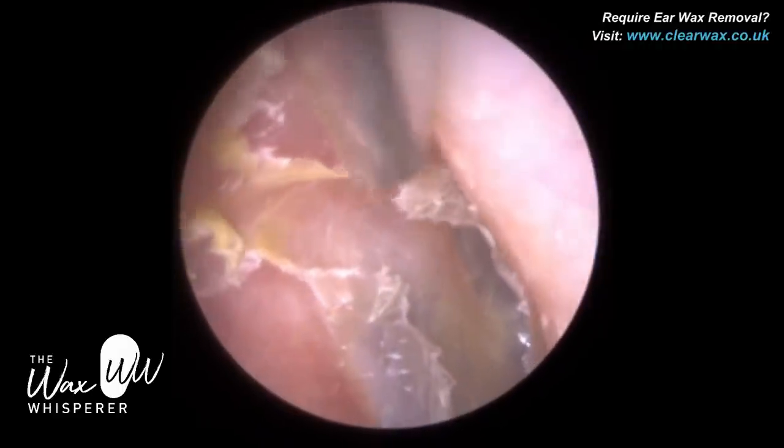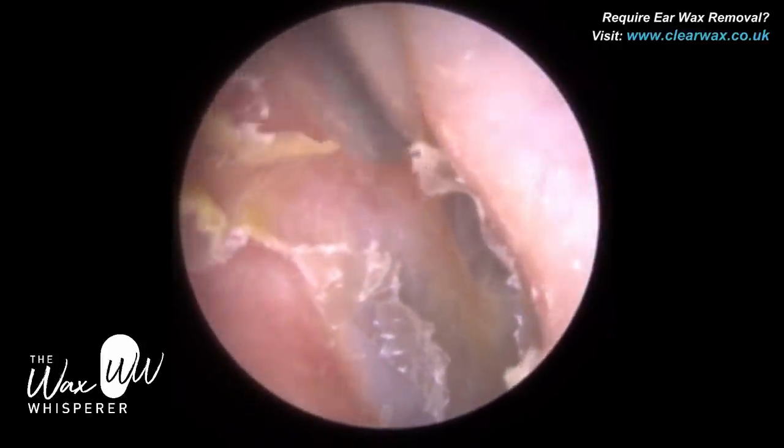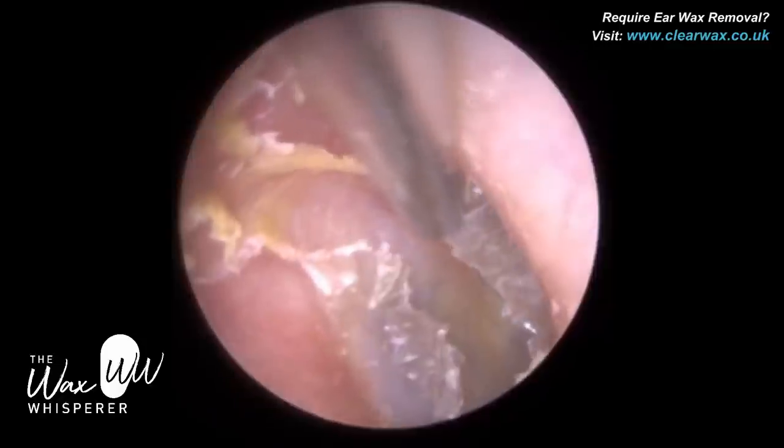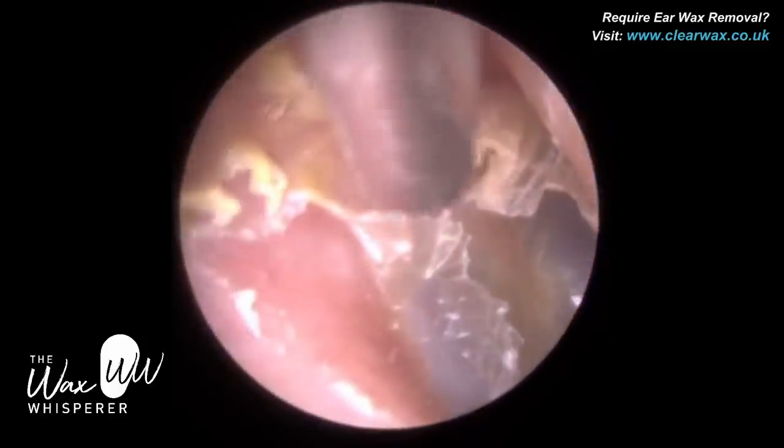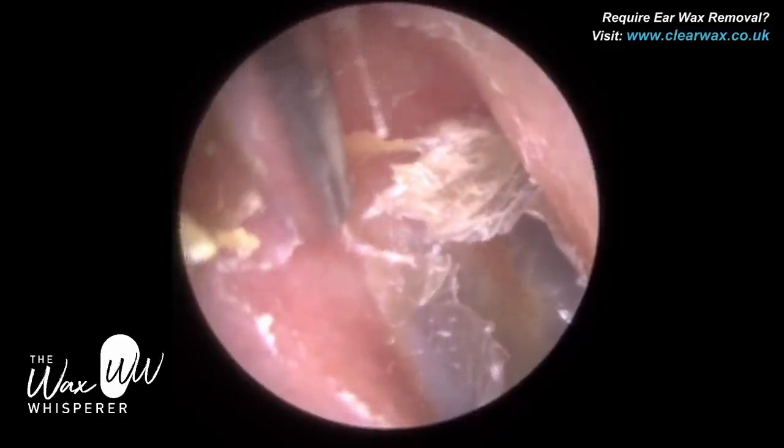If this patient didn't have a hearing aid and they didn't have a hearing loss, they may not attend regularly to have the skin removed, and if not, this skin can eventually build up and lead to keratosis obturans.